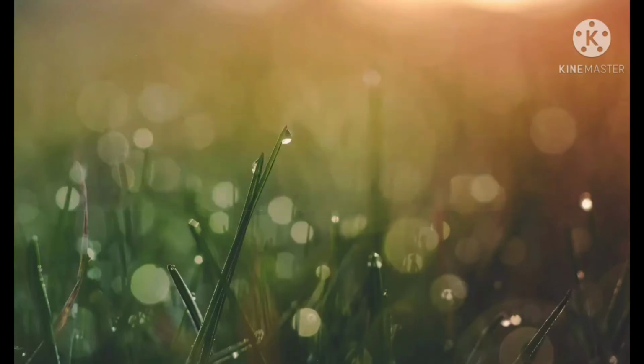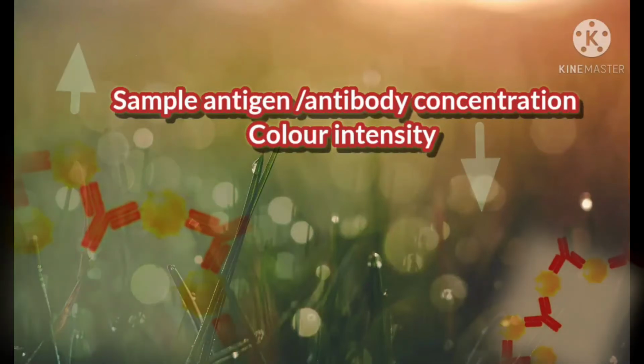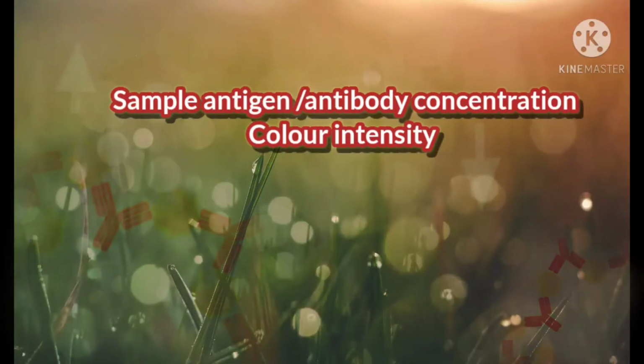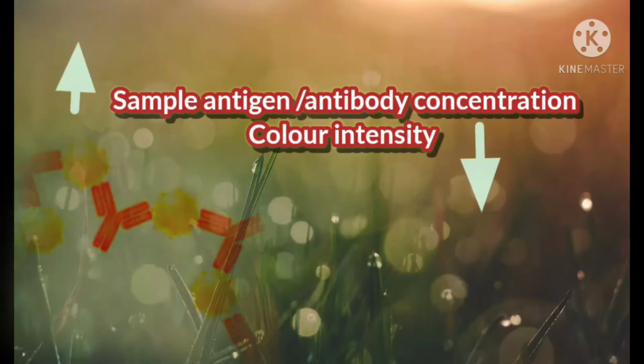The result of this ELISA is inversely proportional to other ELISAs, whereby if the concentration of antigen or antibodies in the sample is higher, the color intensity will be very low.